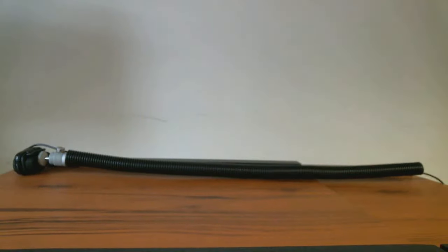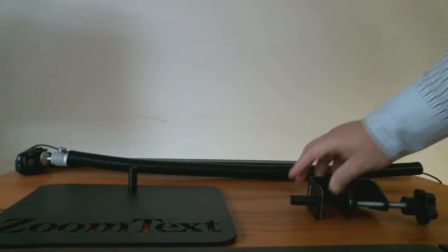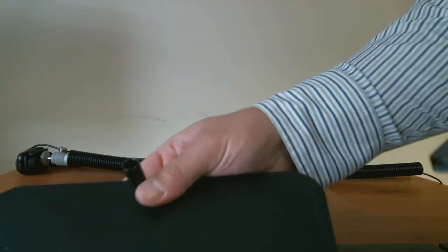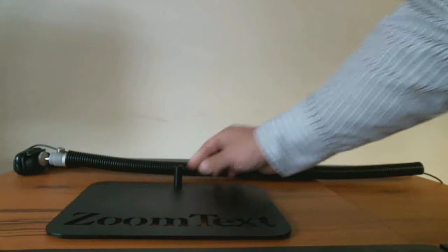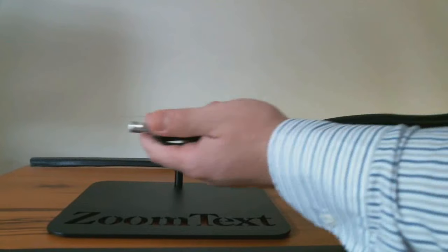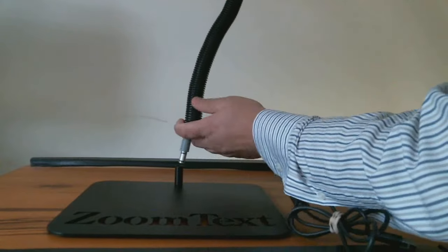And then along with that, depending on which camera stand you've purchased, you'll either have the weighted base plate or the C-clamp. Okay? And now you'll notice that both of these have an attachment on the end of them where the camera itself or the stand fits into that. So I'm going to show you how that works. I'll actually do it with the weighted base plate. So first thing you're going to want to do is at the far end of the camera stand, you're going to see that there's this metal receptacle here, and you're just going to put that right into the camera stand itself.